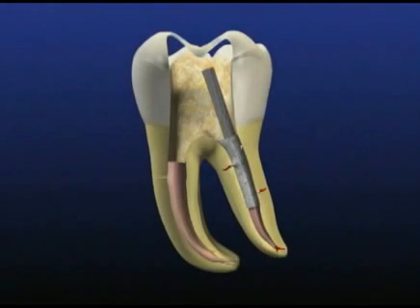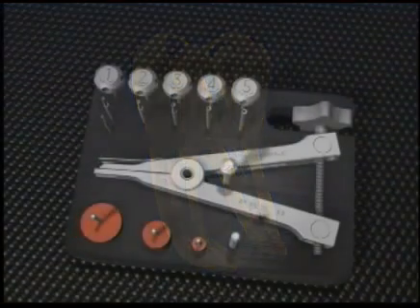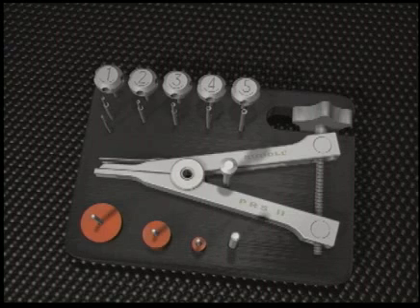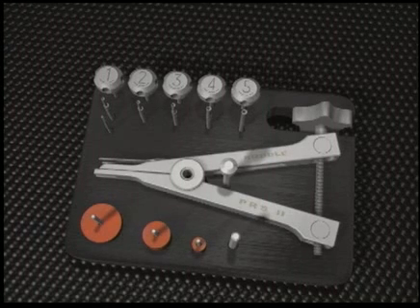Here we have an animated graphic of a mandibular molar demonstrating straight line access and a fully exposed post within the pulp chamber. When ultrasonic procedures prove unsuccessful, we need a fallback option. The PRS kit affords simplicity in use and provides extraordinary opportunity in predictably removing different kinds of post systems and other intercanal obstructions when ultrasonic procedures prove ineffective.